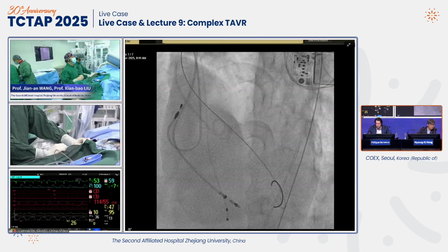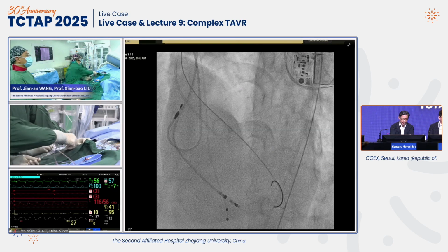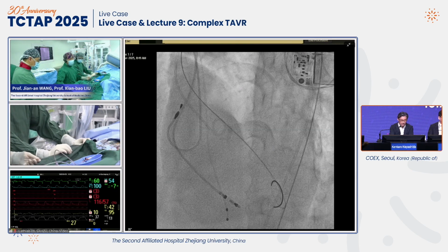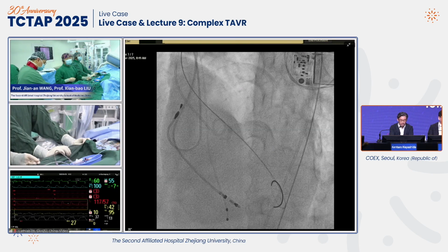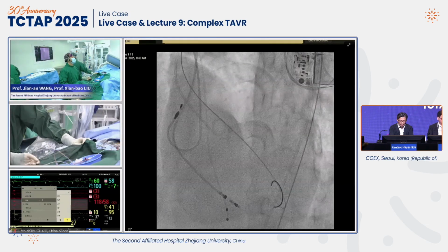Do you have any preference for the balloon type, a ZMED or a true balloon, or a much softer balloon? Yes, I think both of them will work for the procedure. However, we can just get the ZMED balloon in China. We cannot get a true balloon.